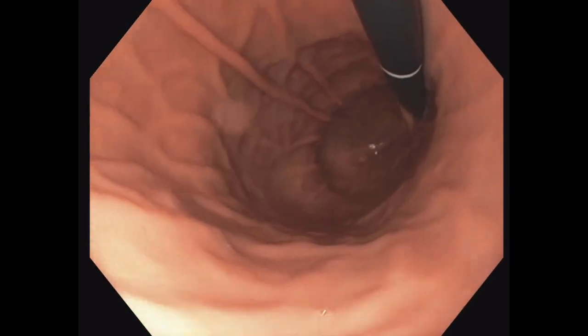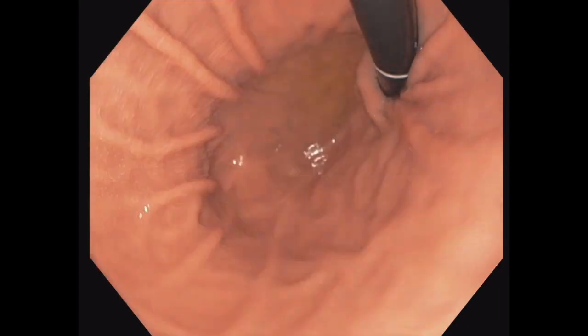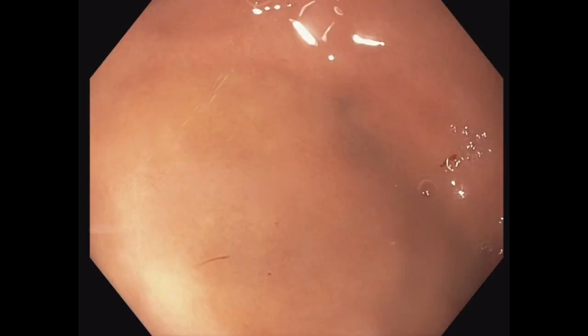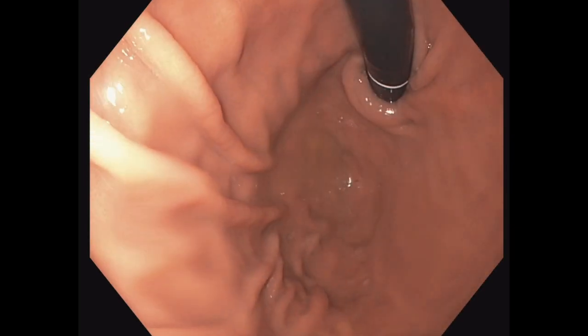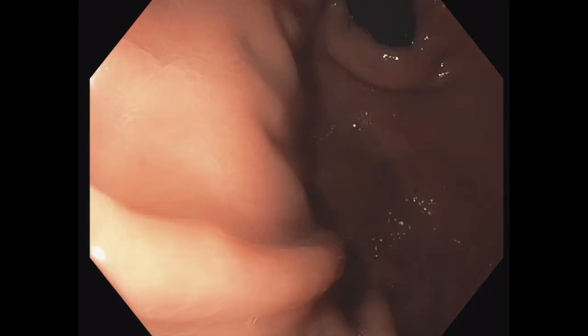The retroflexion view is suitable for observation of lesser curvature of the stomach compared to looking down, so observe there, fundus, and cardia. Also, this position is good to suction the fluid in gastric body since the scope is parallel to the gastric wall.